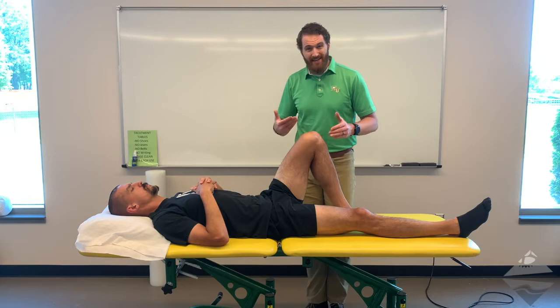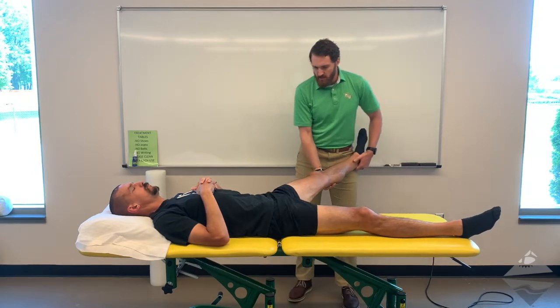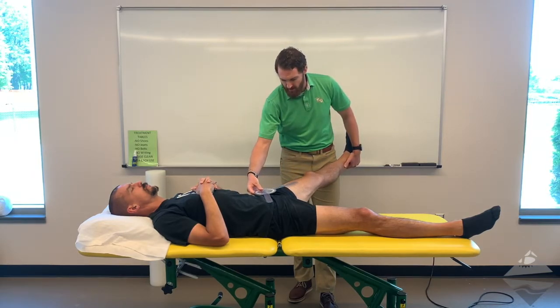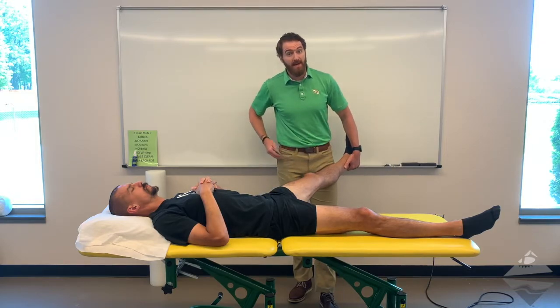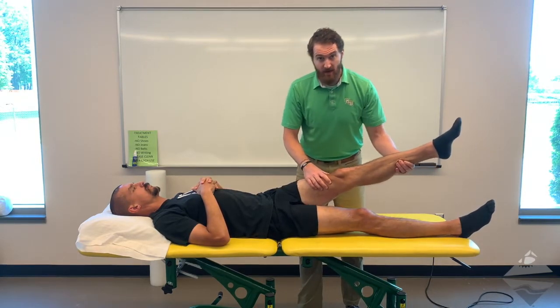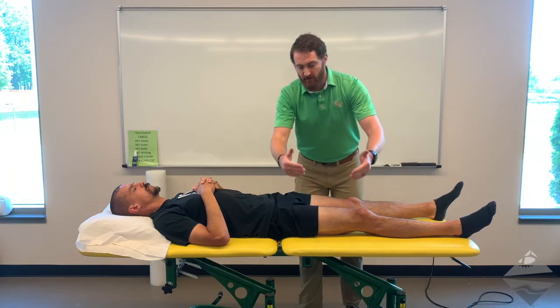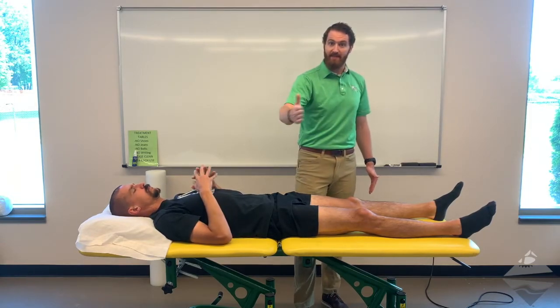We can also look at abduction and adduction in this position. Taking the individual out, the ASIS serves as the reference for the stationary arm, and the mobile arm follows the midline of the thigh. In this case we're looking at about 47 degrees of hip abduction. For adduction, we come across — note that doing it here requires coming into slight flexion, so typically you'd have the patient move the other limb out of the way, slide toward you on the table, and take the measurement staying in the horizontal plane.